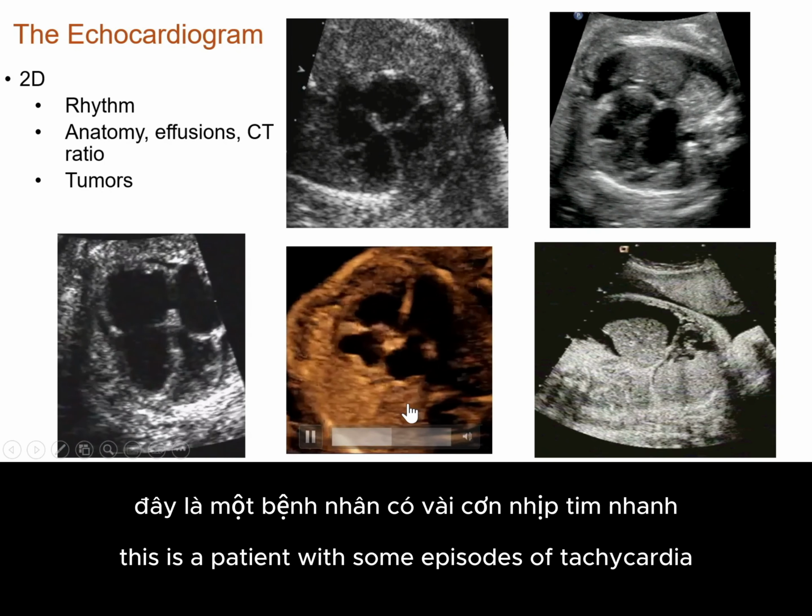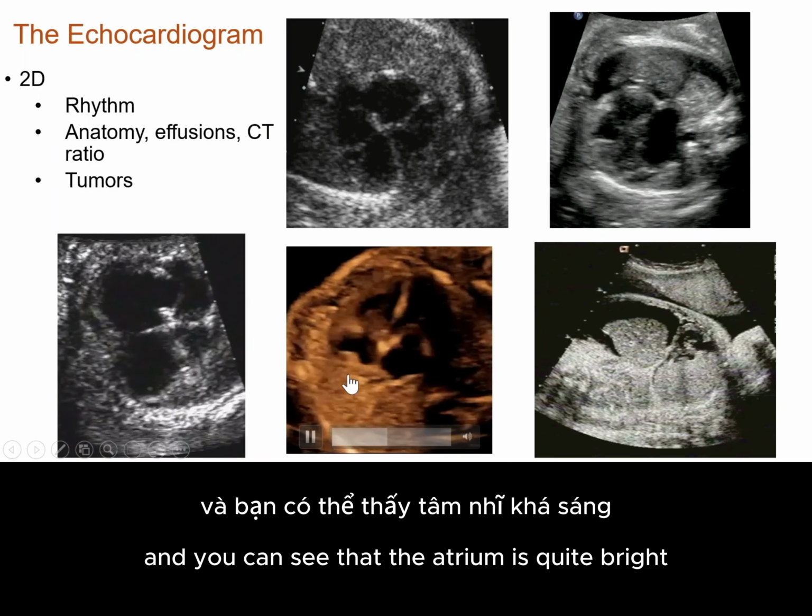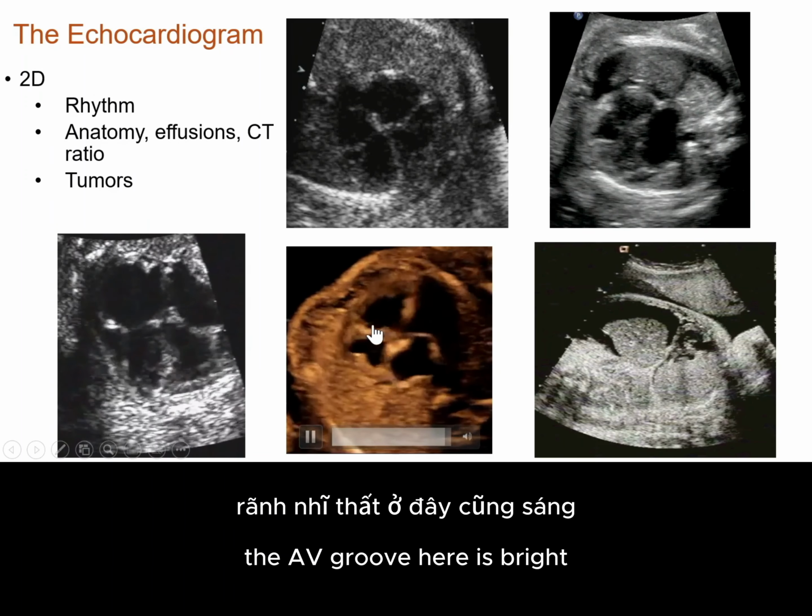This is a patient with some episodes of tachycardia, and you can see that the atrium is quite bright. The AV groove here is bright.